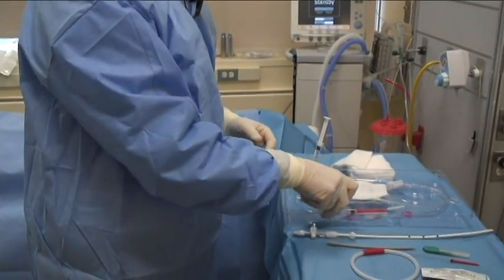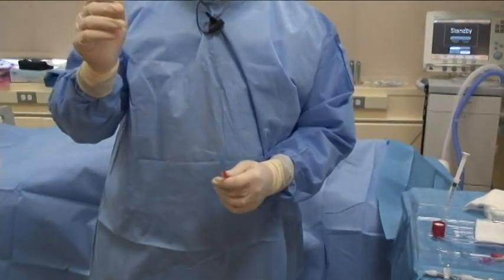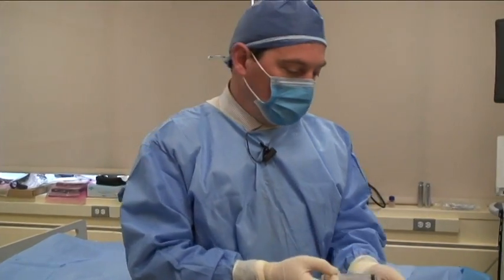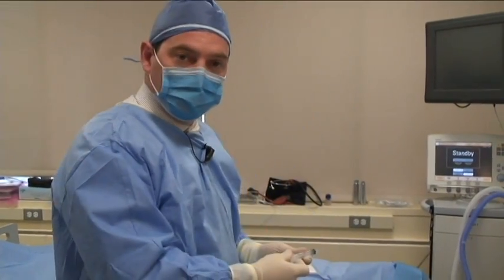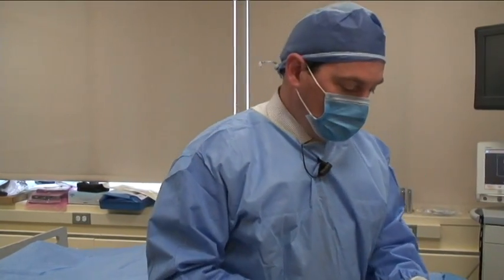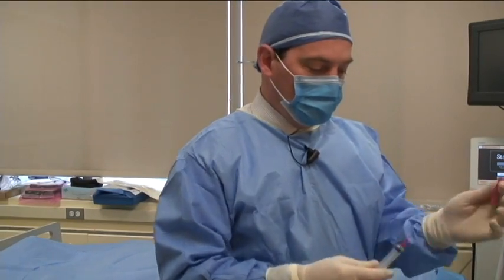So what I'd like to do, even before I actually put the needle into the patient, is to put a few cc's of saline into my syringe. The reason why I do this is as I'm pulling back the plunger as the syringe is going into the patient, particularly if it's a pneumothorax, I'm able to see bubbles in the syringe, verifying that I'm in the proper space and getting air out of the chest space. So what I ask Dr. Gopal to do is to hold up a bottle of saline for me. I'm using a blunt tip needle.